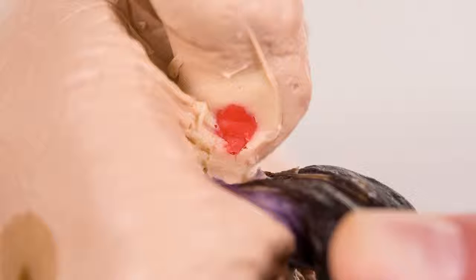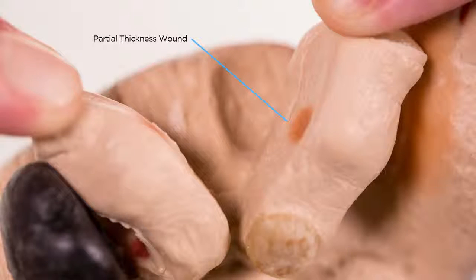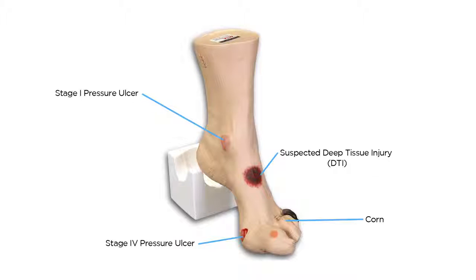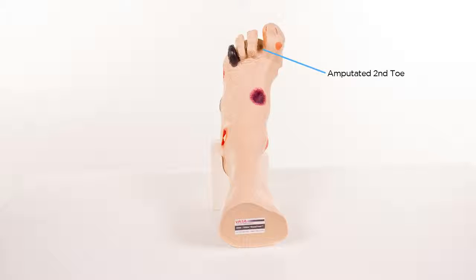Necrotic 5th digit. Interdigital maceration between the 4th and 5th digit. Partial thickness wounds between the 3rd and 4th digit. Corn at the base of the 3rd digit. Callus on the tip of the 3rd digit. Amputated 2nd digit.